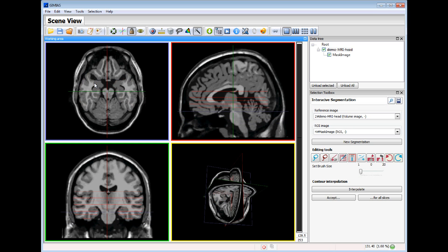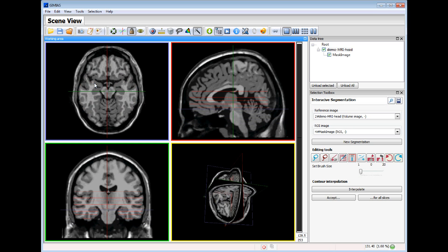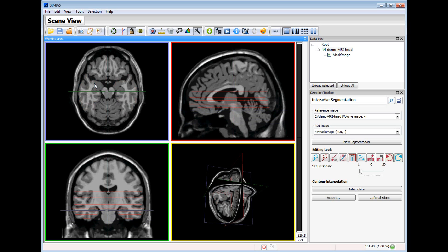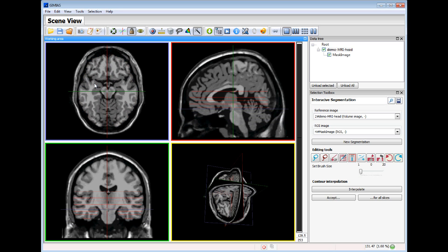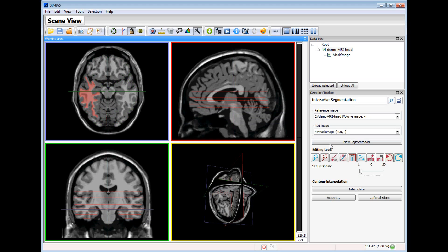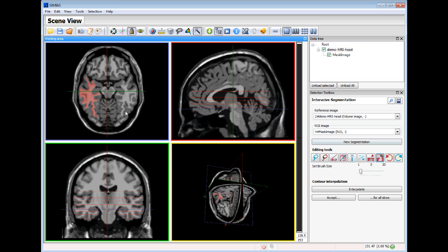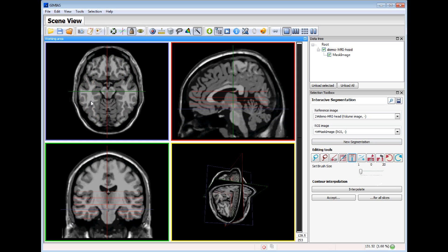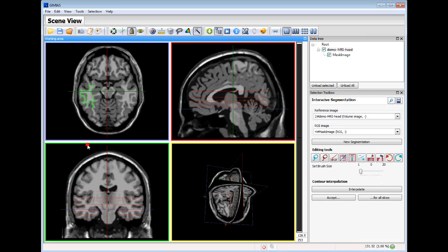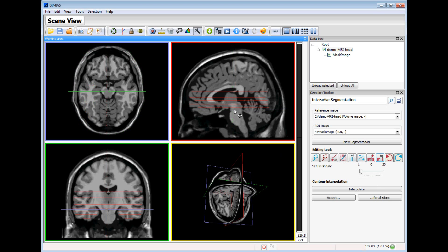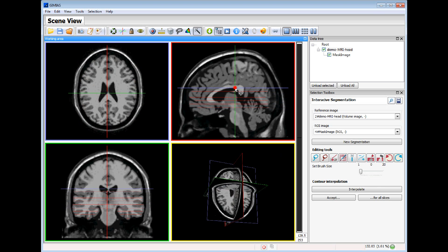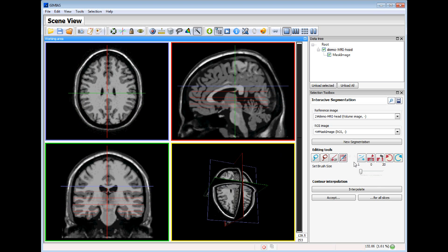So now we go up. If this part is not correctly segmented we can remove it using the erase tool, and we can continue with the segmentation with the region growing. And we can erase again these parts. So we go up to the other slices.